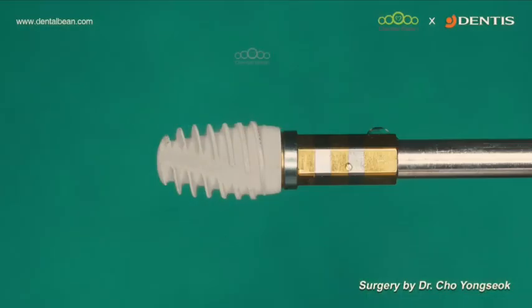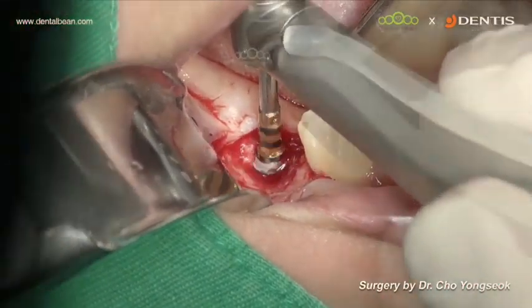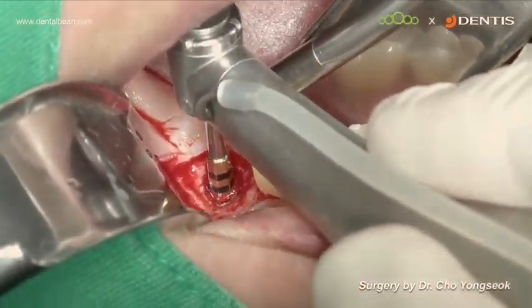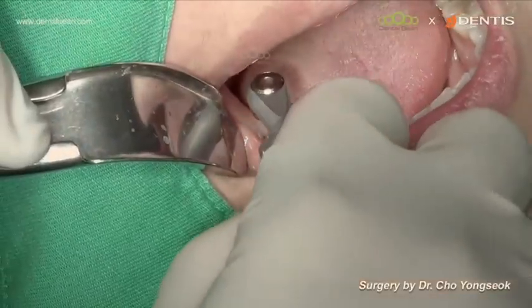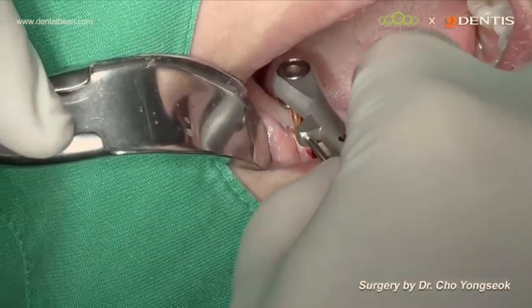Here a 4.6 by 7.5 implant was placed. Carefully control the angulation of the implant and place the implant deeply enough.